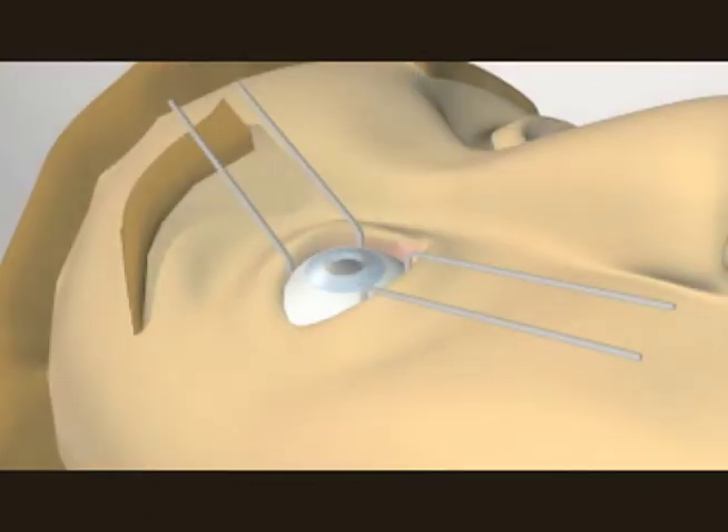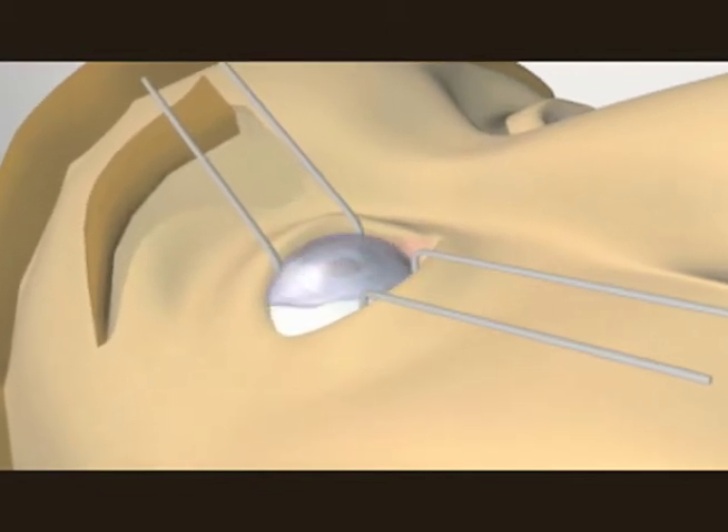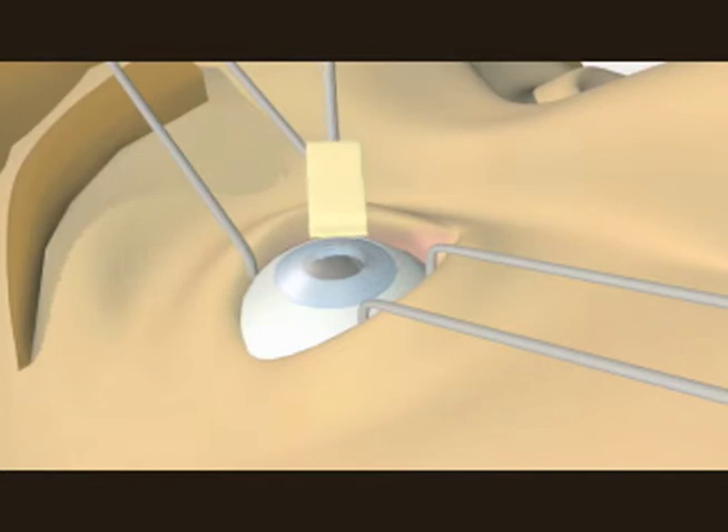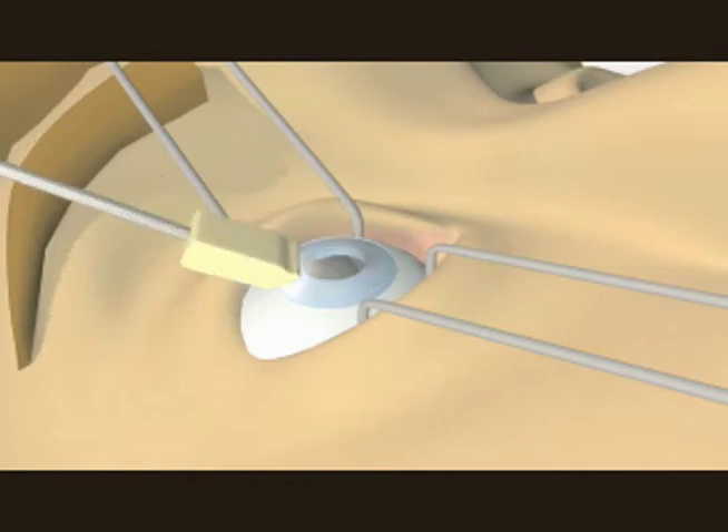The cornea is sealed in a matter of minutes with antibiotic drops that aid healing and reduce the risk of infection. LASIK surgery is completed in a total of 10 to 20 minutes. After surgery, patients can return to their regular activities within 24 hours. The eye is completely healed in one week.